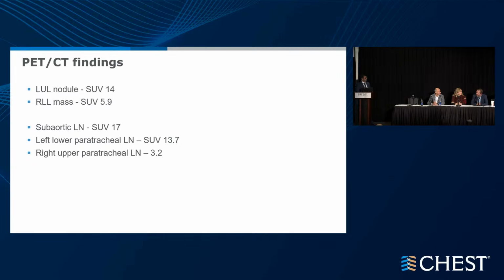I suspect we're going to get disease in the nodes, and so in that situation, you could potentially save time and cost by just doing the EBUS. But I'm still concerned these are distinct processes. So I think I would biopsy both parenchymal lesions as well as all the nodes to try to stage this patient as accurately as we can. And in that case, when I'm going to get the periphery anyway, I start with that. So I would start with navigational robotic, go after both primaries, the right lower lobe probably first, and then I would stage the mediastinum.